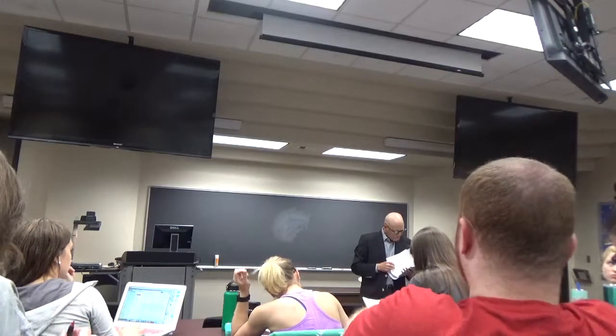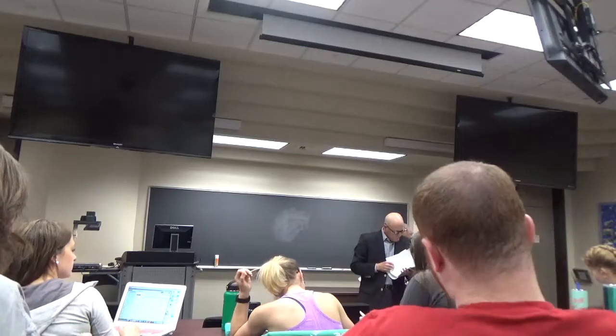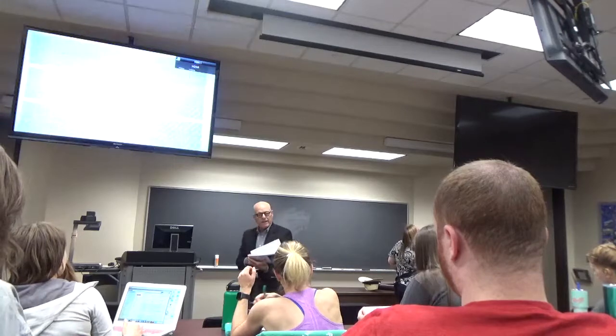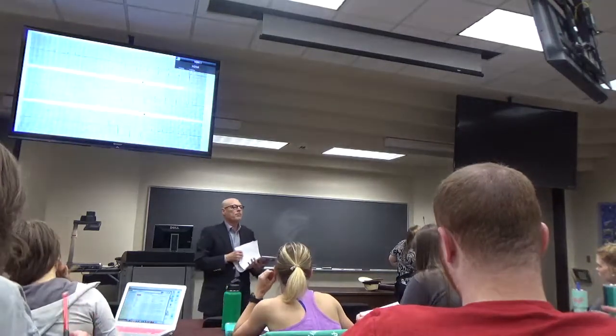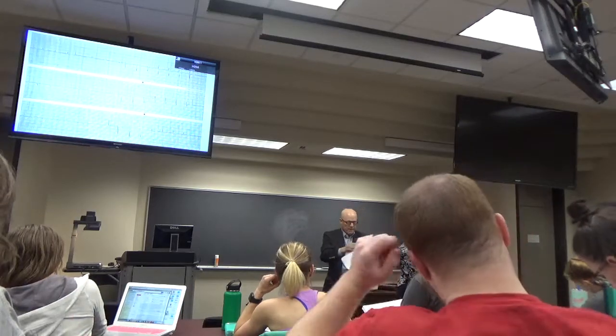Would it be ventricular hypertrophy? Because of the S waves in V1, they go below, like down so far. That would be left ventricular hypertrophy. Right ventricular hypertrophy would be a tall R wave in V1 and V2. Okay, thank you. 45.